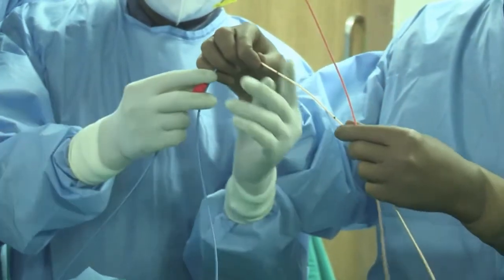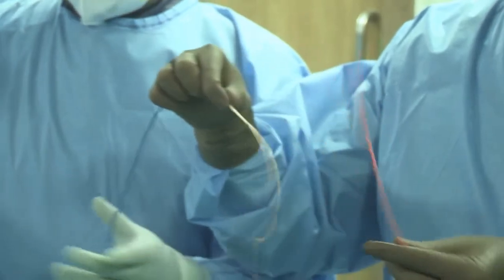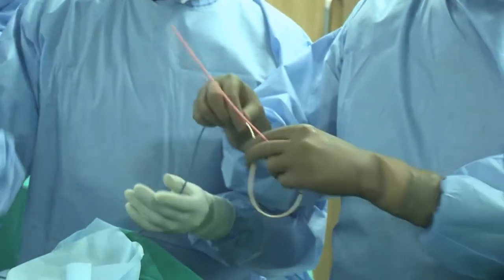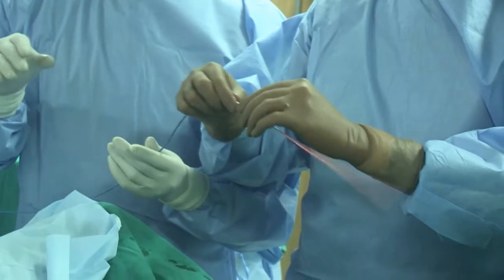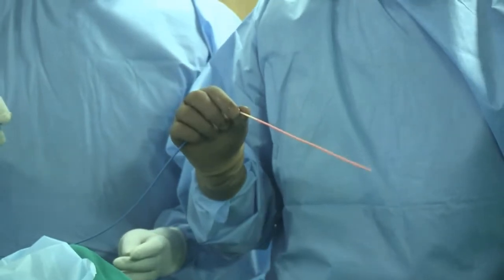There are two markers, one for the 90 centimeter guide, and so we can see the two markers which are there. And so we will go with these markers. So I'm just loading this system from behind. There's no need to put a wire before you do that in the guide. Yes, I have to, because I'm going to put the wire now into my 5 French system which I have taken.